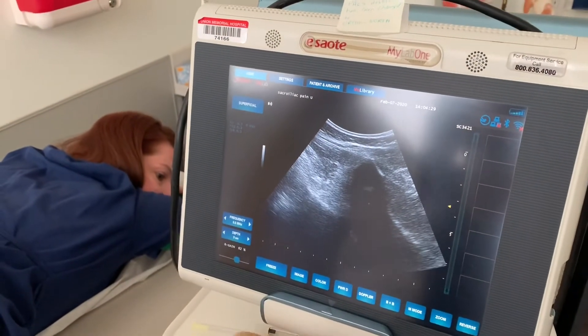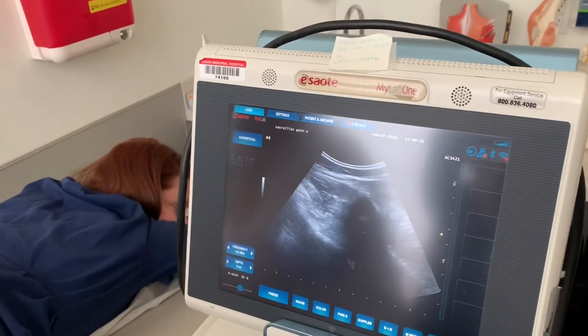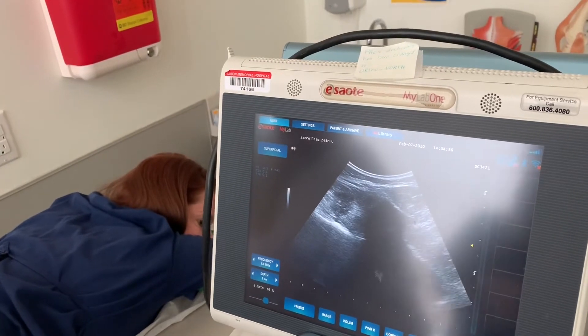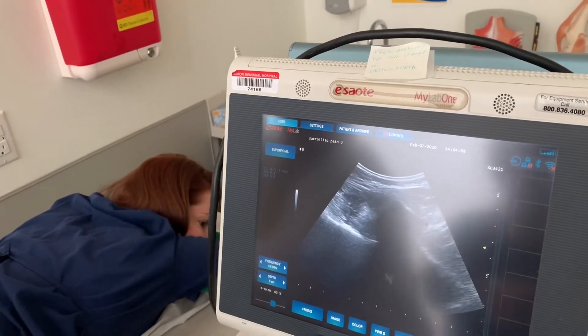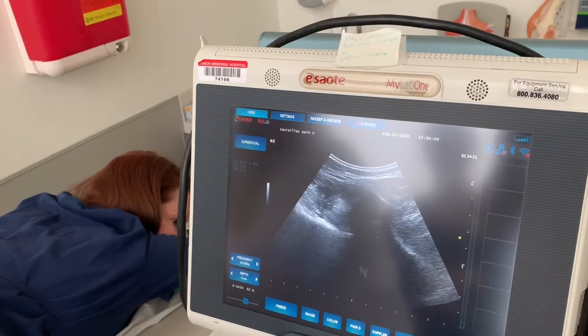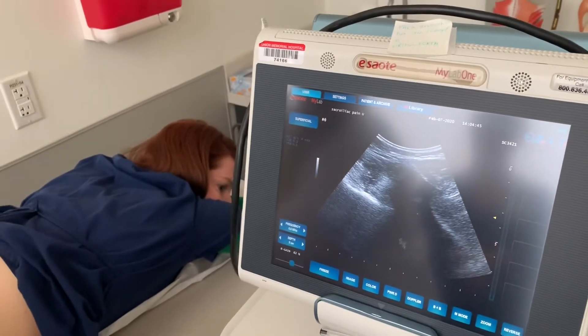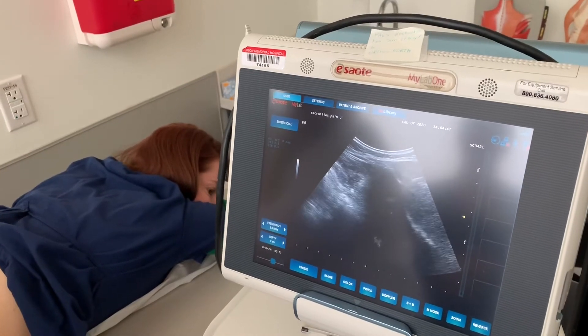We introduce the needle medial to lateral at about 45 degrees of inclination. You follow the bone on ultrasound until the needle just hits the bone — and that's when you know you're in position.